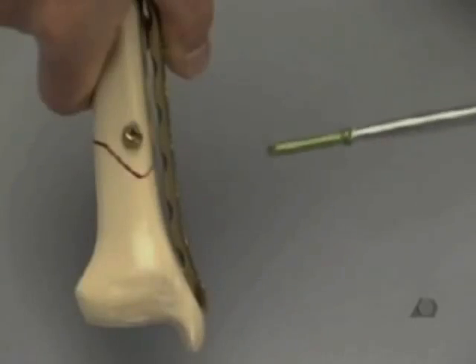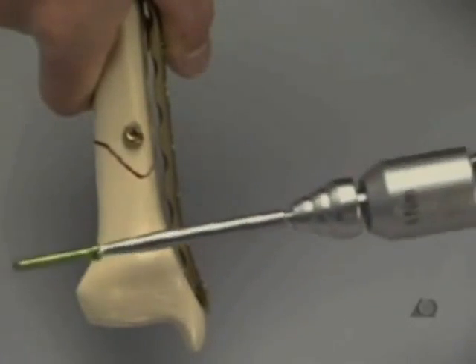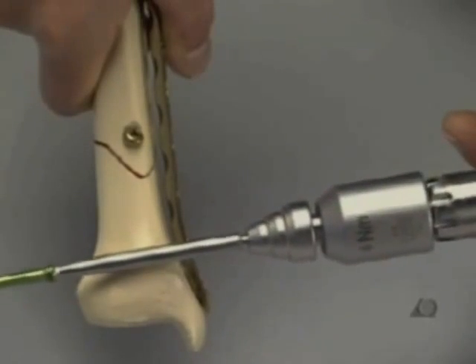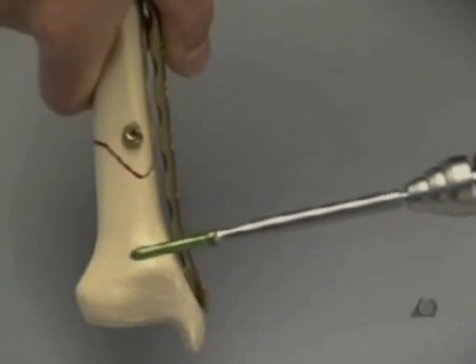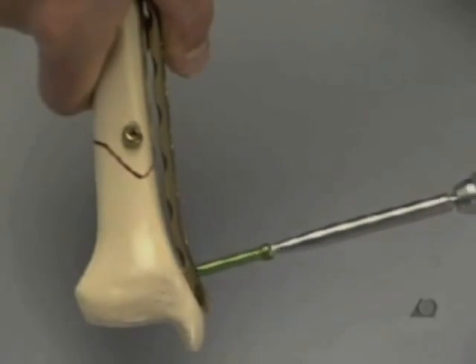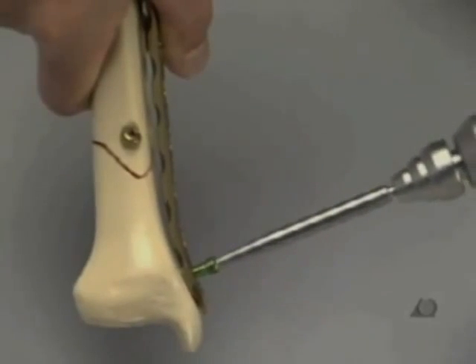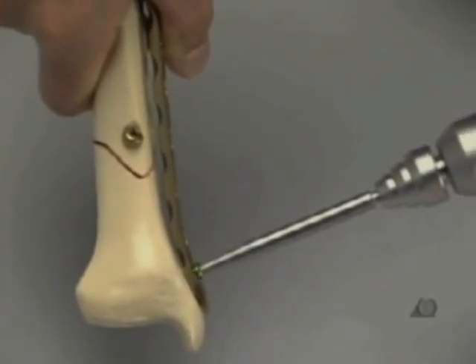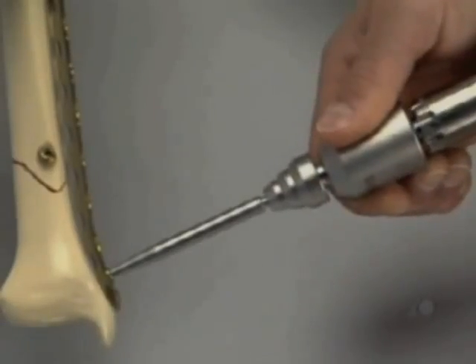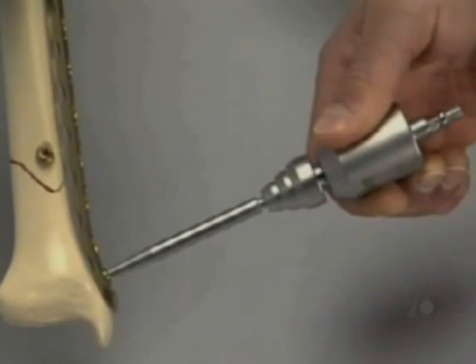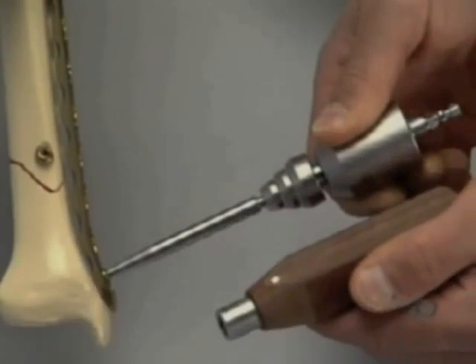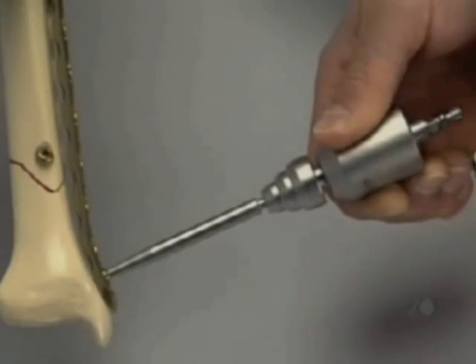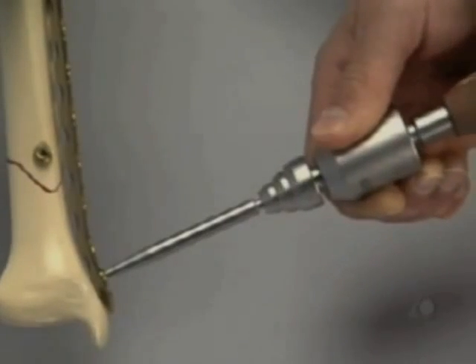The green self-tapping locking head screw is inserted with the torque limiting screwdriver attached to the power drive. The last turns have to be done by hand to prevent the thread from jamming, so the power drill is exchanged for the handle of the screwdriver.